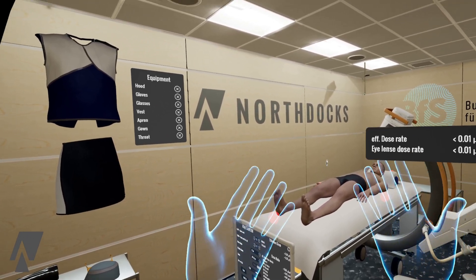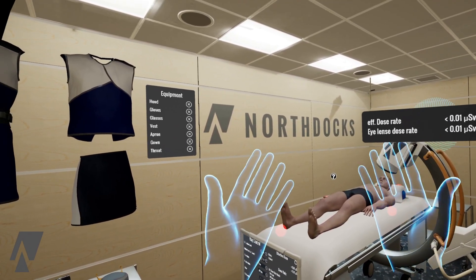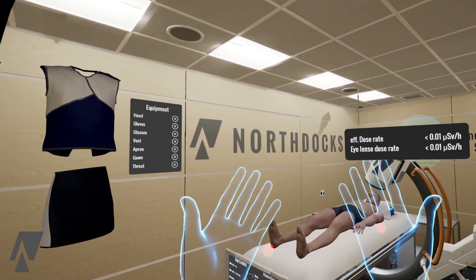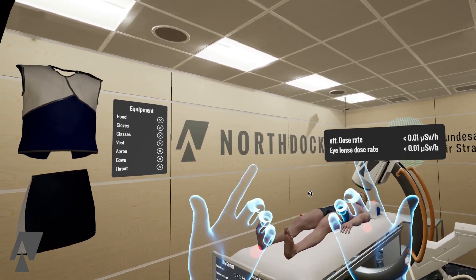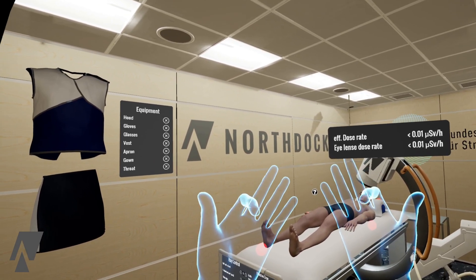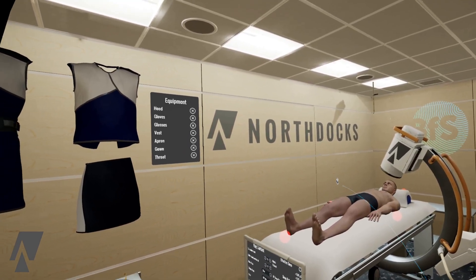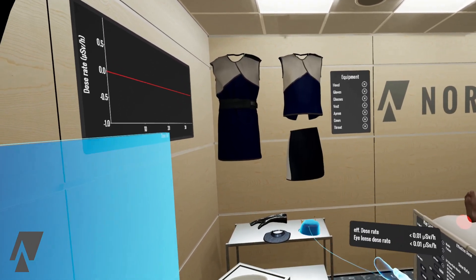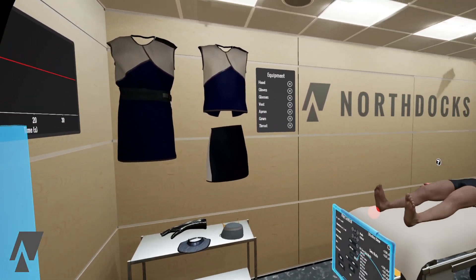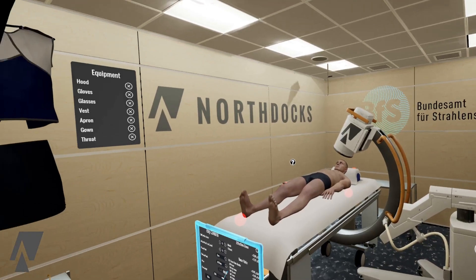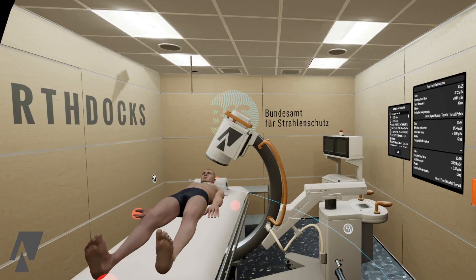Let's start with my hands. I can use the virtual reality controllers to grab things and click at things. For example, I can choose my protective equipment, which I will do later, and I can also click things like this little question mark over here.